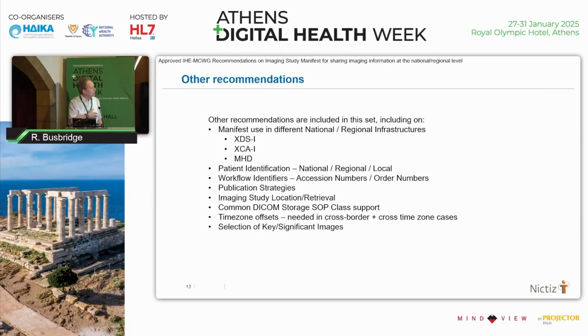We talk about some recommendations on the patient identification, and that's another key topic. If you're talking about local systems, typically you have a local patient identifier that's known within your own hospital. If you move that image then to a regional level, it may be that you need to include a regional identifier. When we go to national and then cross-border, we have to include a national identifier. And we give some recommendations on how that is done within the DICOM identification scheme. DICOM only allows the primary identification of one identifier, and we recommend that is then the national identifier, and any other identifiers that are known for a patient should then be copied into a sequence of alternative identifiers.